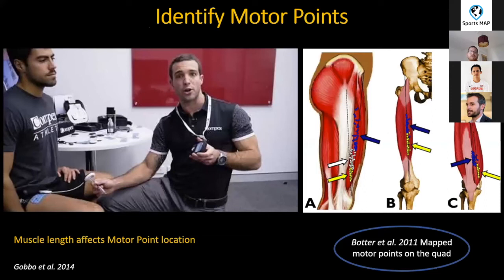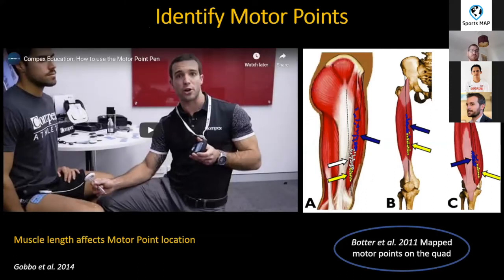So if finding motor points is important, how do we do that? I've got a couple of little YouTube videos in the next couple of slides, just because all my gear is locked away at university. This quick one from Compex just shows how to locate motor points quickly. So hopefully.